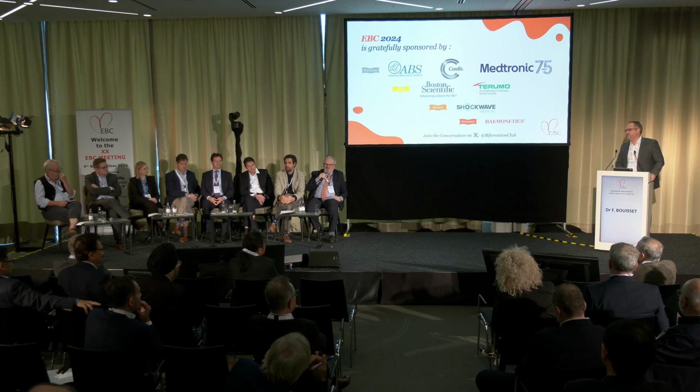But if I can make just a comment, of course, photon counting will solve this quality problem, but already with a standard scanner, if you go to your radiologist, explain what was mentioned before: when you see calcium, please increase the kV, please use nitrates. Show them the type of images that you want to get. Already today, with their current machine, they can probably do better. But we need to push, that's also our role. We need to ask them, this is the standard now, please improve your quality. I'm in France, photon counting in my hospital is not for tomorrow, I know. But already, with what we have, we can improve our quality.